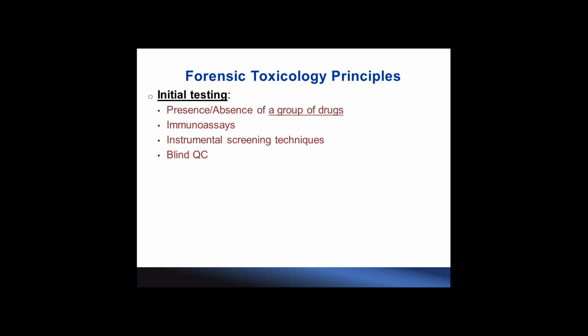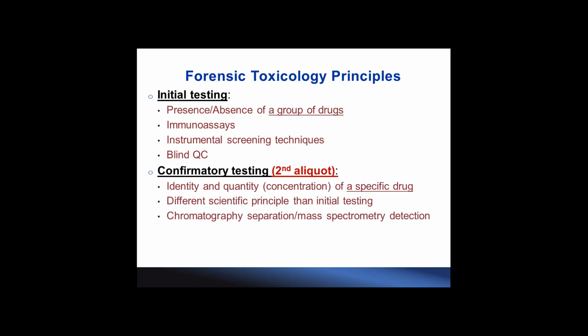For the samples that are tested presumptive positive, in our toxicology lab term, the samples will be referred to confirmatory testing. There are two purposes of doing this. One is to confirm that what we screened positive is actually positive, and two, we report what it is actually positive for. We report it with identity and quantity of a specific drug. So it is, again, done by a separate aliquot from the initial testing that we did.